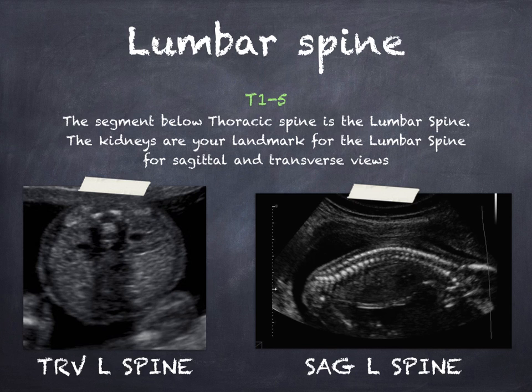Moving on, we have the lumbar spine, and this is where you'll see the kidneys. They will be your landmark for the lumbar spine.